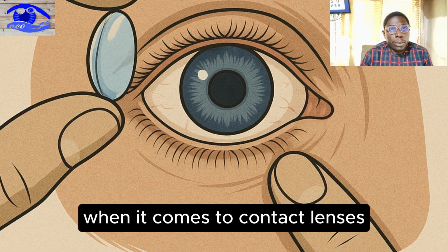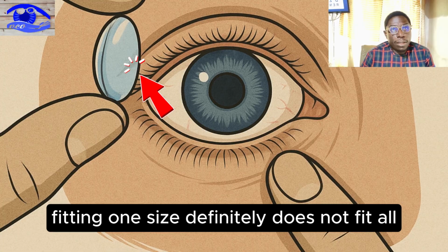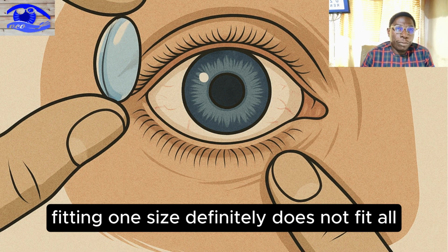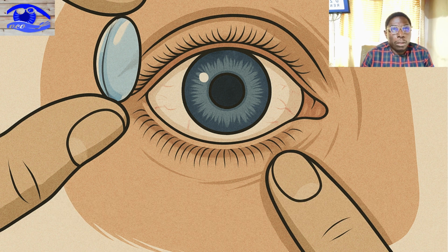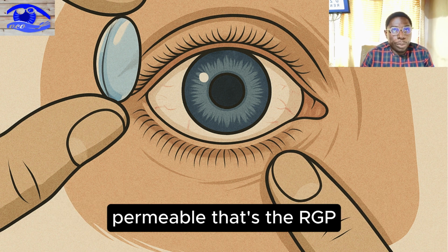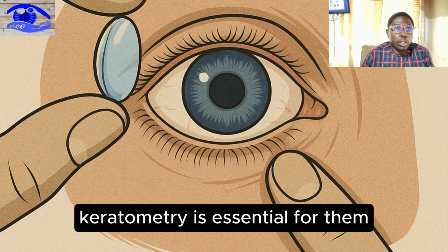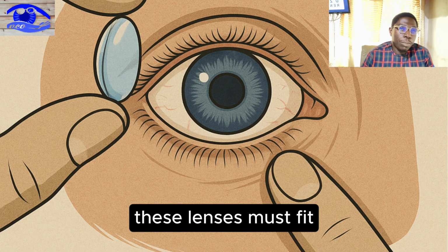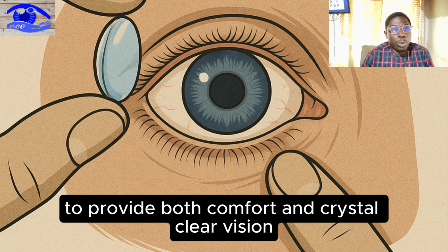When it comes to contact lens fitting, one size definitely does not fit all, especially for those with unique corneal shapes. For people who wear rigid gas permeable, that's RGP lenses, keratometry is essential. These lenses must fit the cornea's surface with precision to provide both comfort and crystal clear vision.